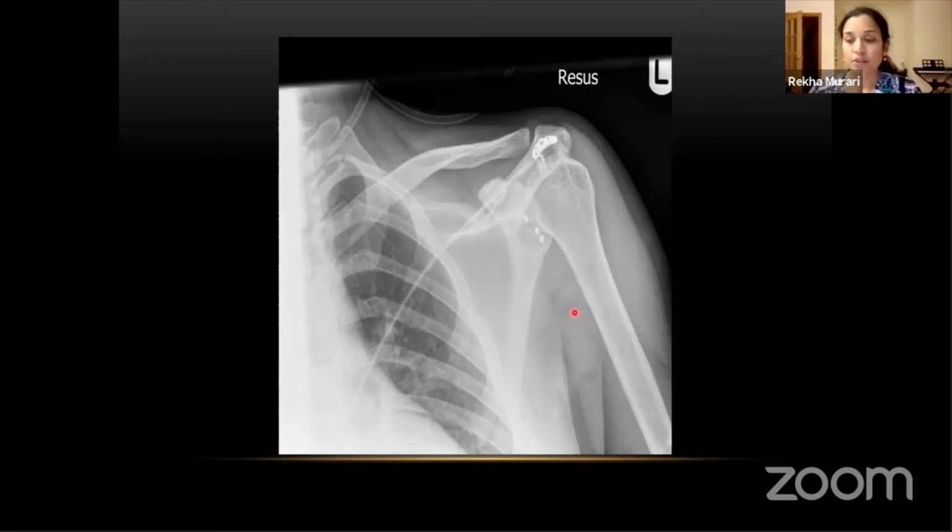So pneumothorax is a very important diagnosis on X-ray. And when I was getting trained, on any X-ray I started to first rule out pneumothorax and then start looking at everything else, because it's important. And the things to look for, can you see? That is the lung margin. So you will be able to see the lung edge in pneumothorax.